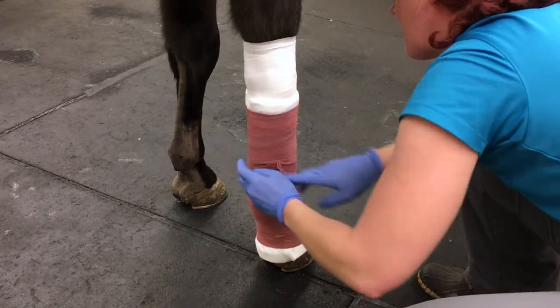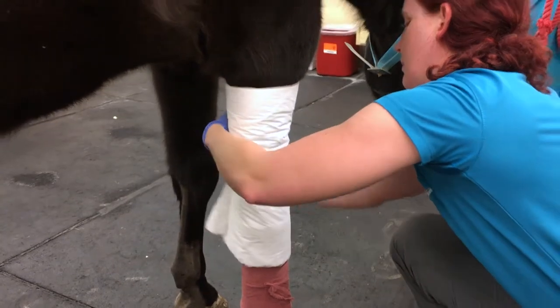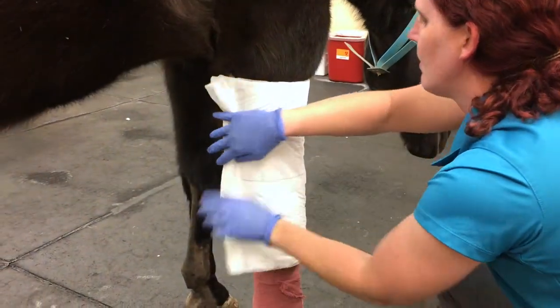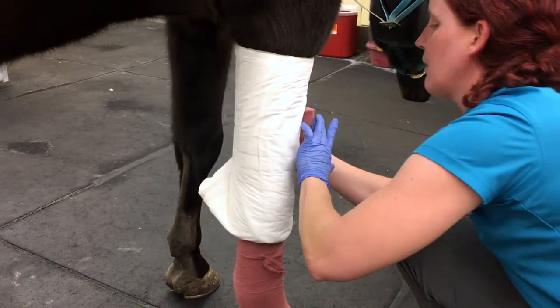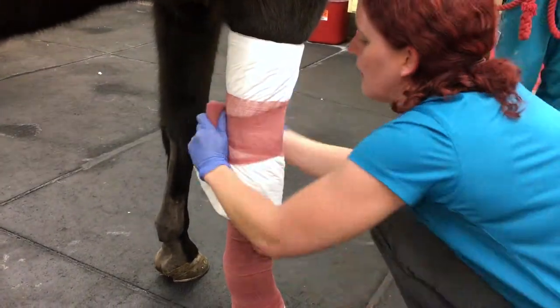Tuck in the end of the brown gauze when you reach the end and get your second combi roll, overlapping it onto the first combi roll. Then take your second roll of brown gauze and apply it firmly around the combi roll.